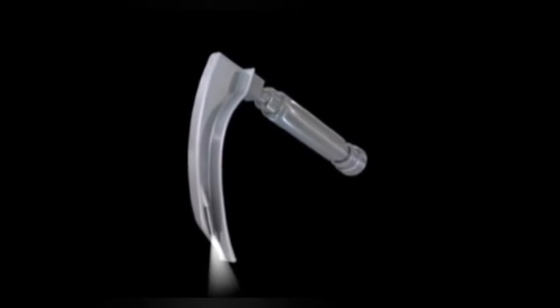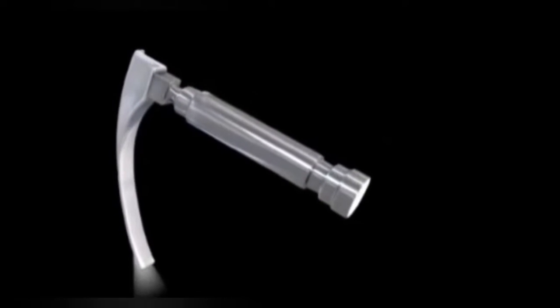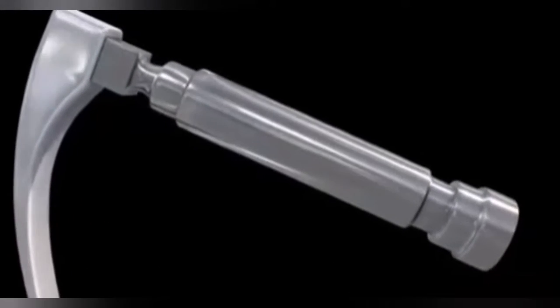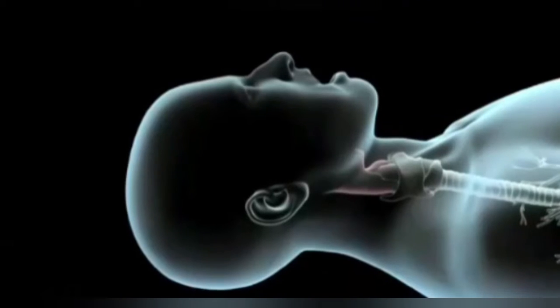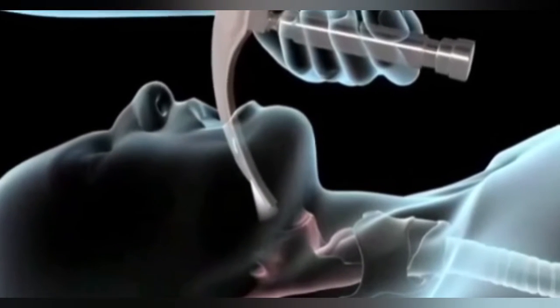Intubation is called endotracheal intubation. Once you're asleep, your doctor will use an instrument called a laryngoscope. This device helps guide the endotracheal tube to its proper position. Your doctor will tilt your head back slightly and insert the laryngoscope through your mouth and down into your throat, taking special care to avoid contact with your teeth using a special blade on the device.